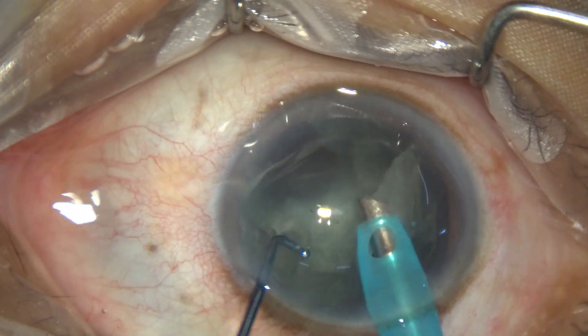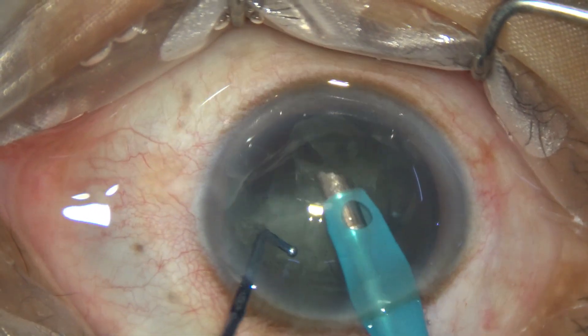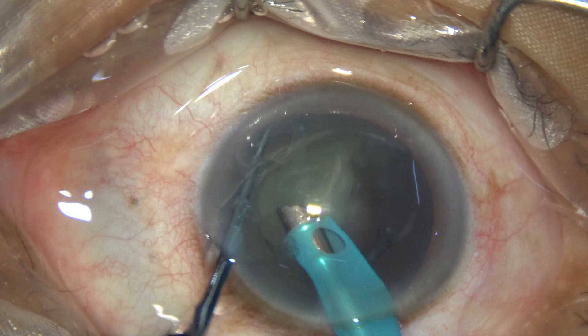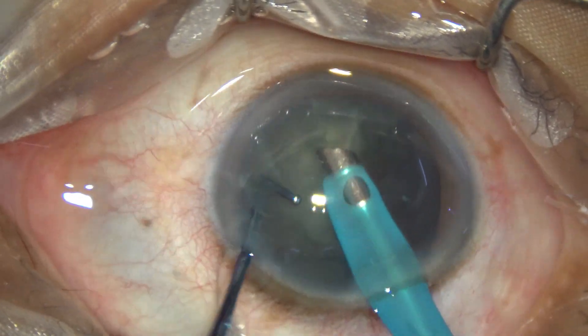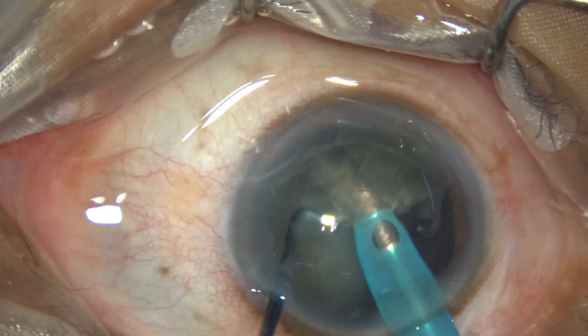It is straight; its front edge is the cutting edge, the back side is the blunt edge, and it is straight. It is not curved like my friend Dr. Sohail Khan's Prechopper.